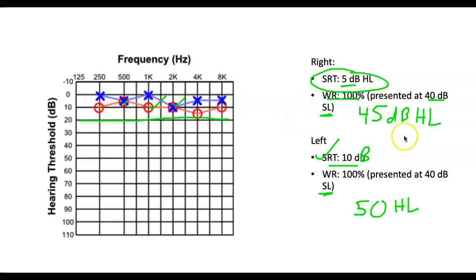So that's within 10 dB, and the same thing for the other ear. Okay, so you can calculate and compare your SRT to your pure tone average.